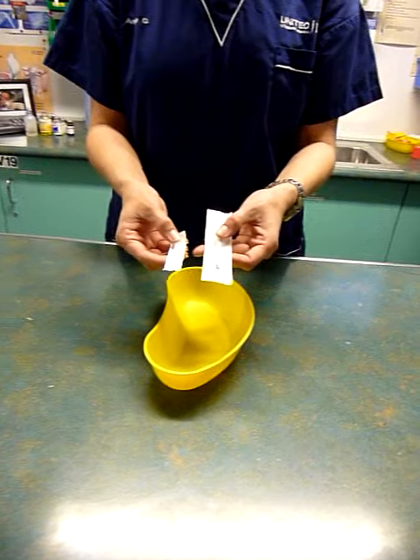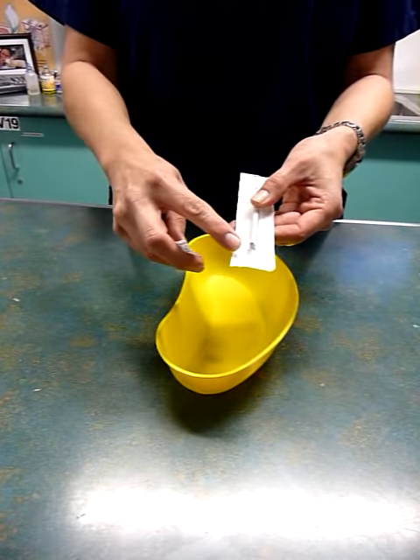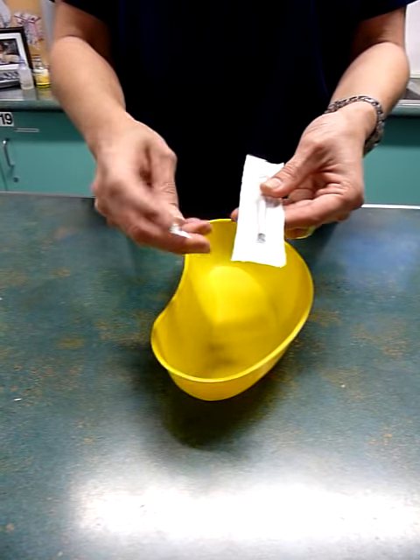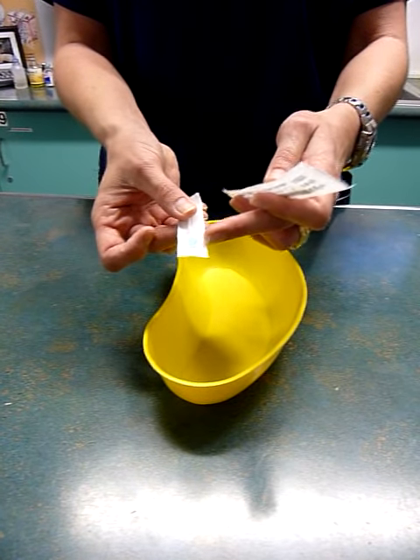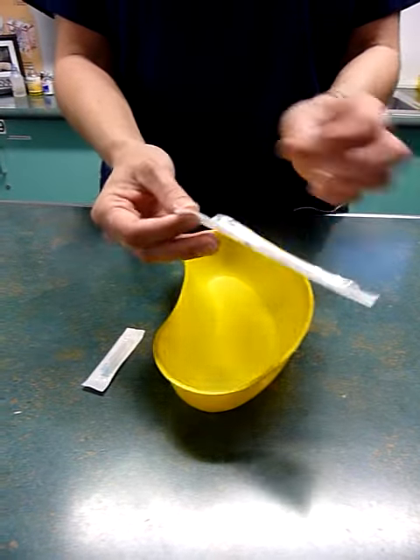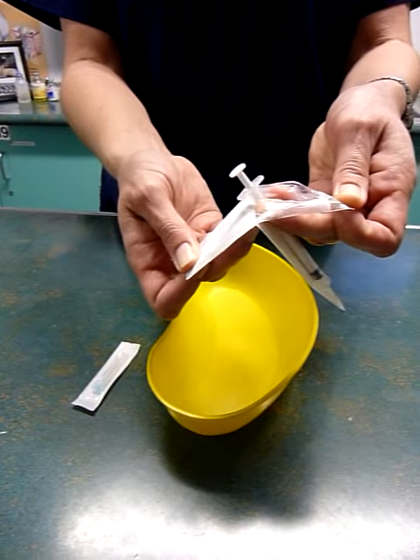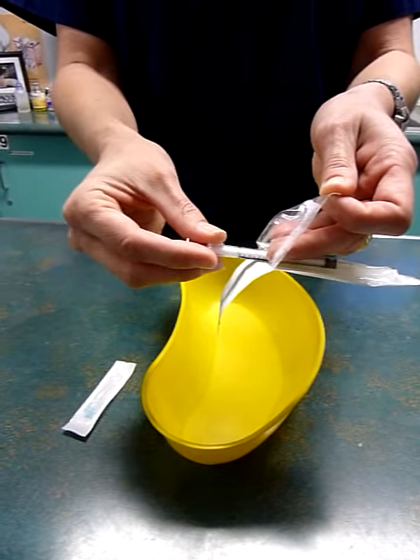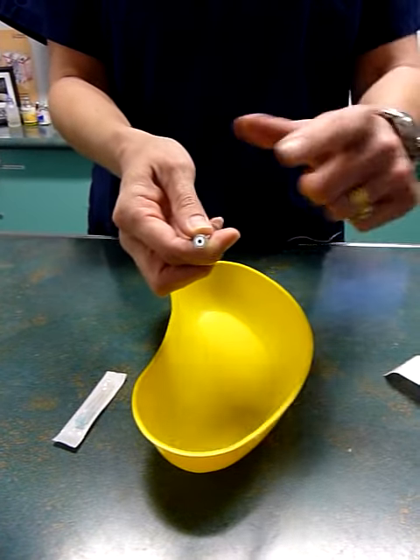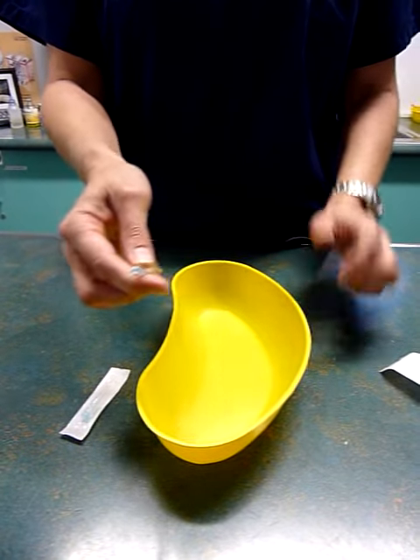Syringe and needle — what we are going to do today is put these two together. It is very important that the end of the syringe stays sterile and the blue end, or the coloured end, of your needle also stays sterile. First of all, we are going to peel the syringe out of the paper with the plunger end — it's okay for us to touch this end. Always ensuring that you don't put this down on the table or on anything dirty.